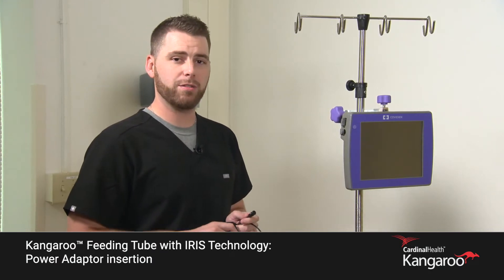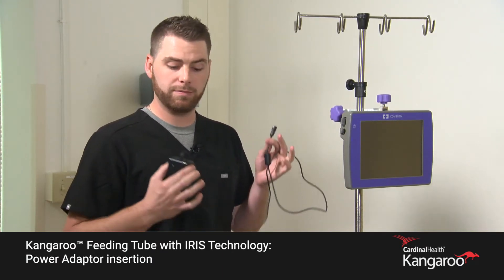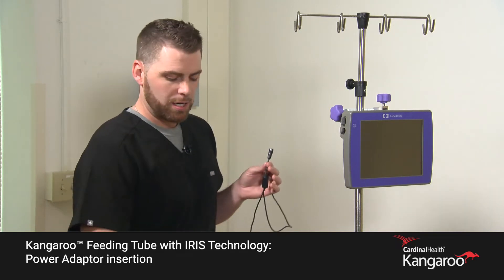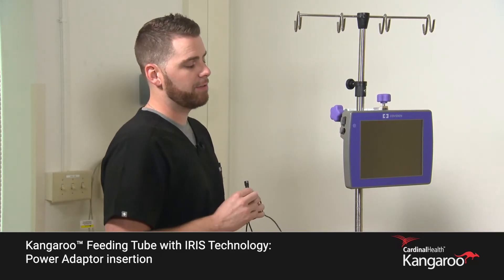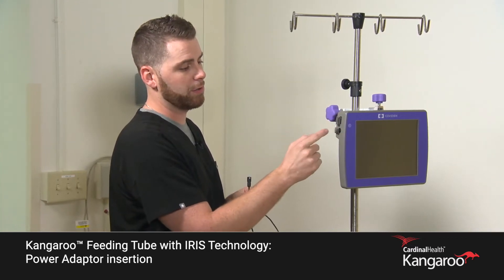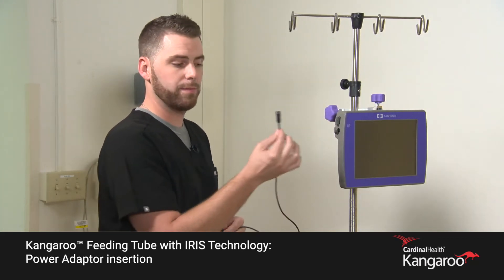Today we're going to discuss the Kangaroo feeding tube with IRIS technology and how to correctly attach the power adapter. On the console itself, on the top left-hand side, you'll have two tabs. The lower tab will be for your power connection.